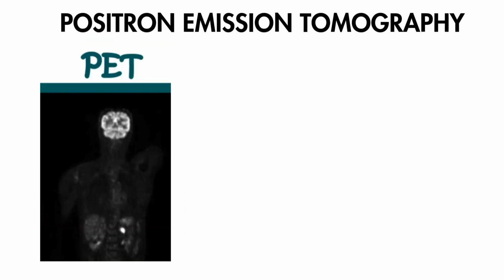As seen in the image, there is a small tumor in the abdominal region. This particular white dot represents an abnormal activity, but this can be non-conclusive. You cannot conclude where it is placed, what the depth is, whether it is placed in the kidney, the abdomen, or the stomach.